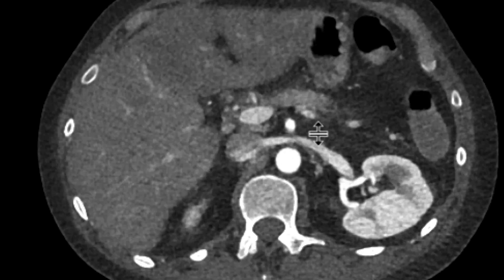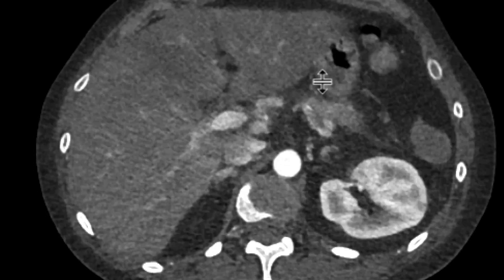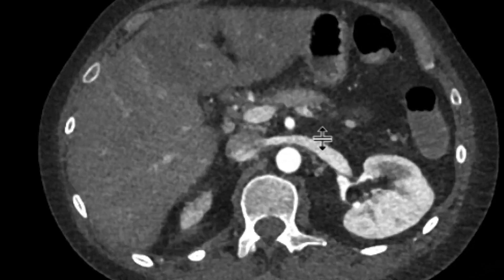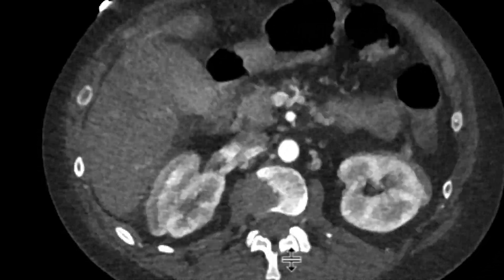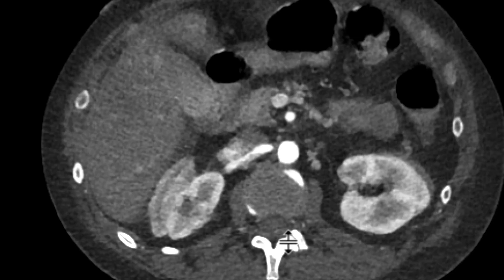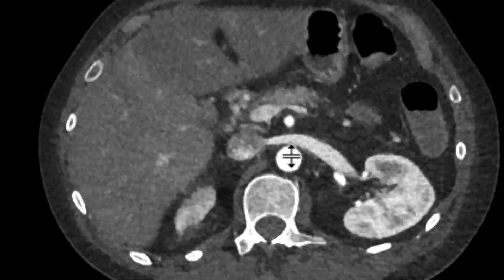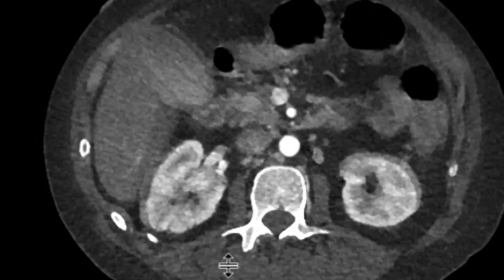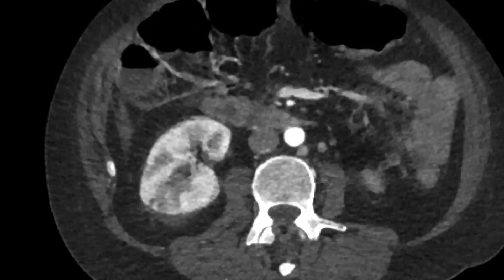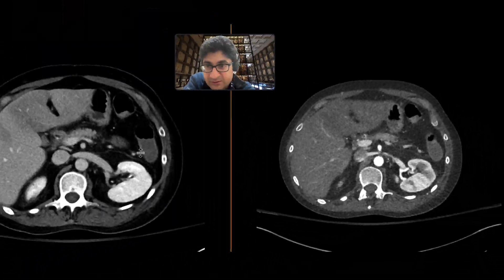Maybe we can see a little bit of it over here. In that context, what we're seeing in the liver is highly concerning for ischemia. And whereas we don't quite see thrombus in the renal arteries, it's not unreasonable to think that some portion of that thrombus came off and caused those renal infarcts — those wedge and linear shaped areas of decreased attenuation within the kidneys.